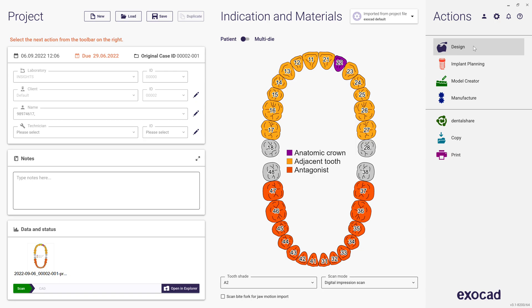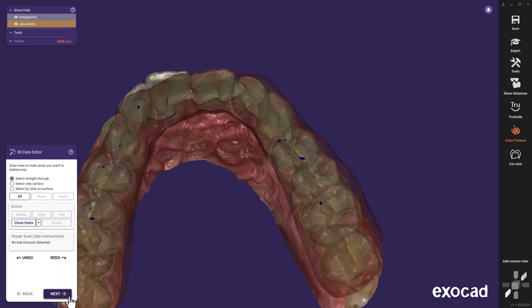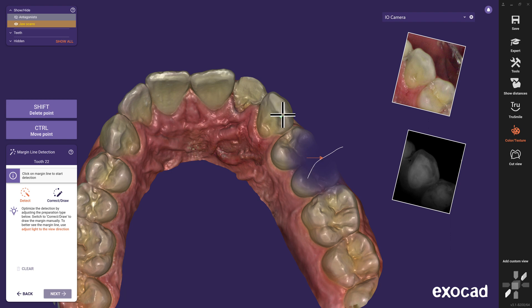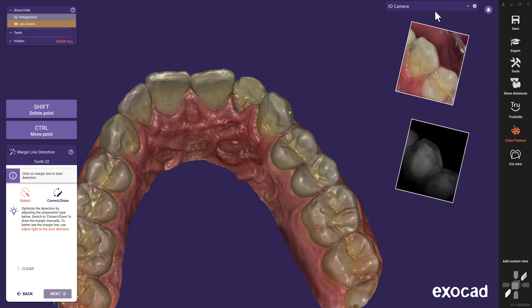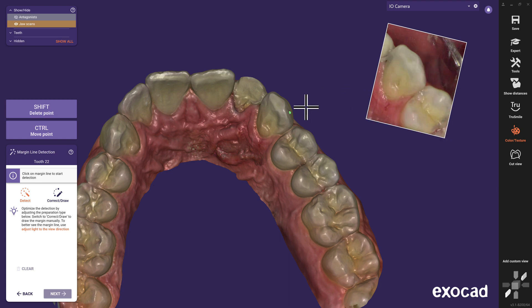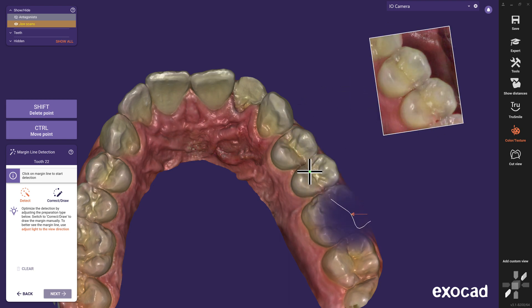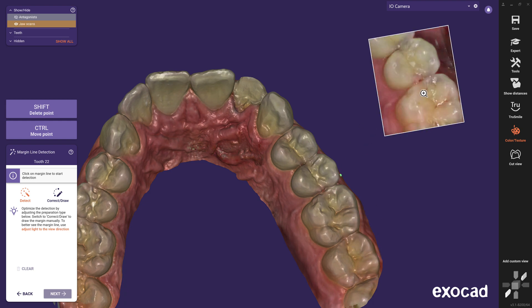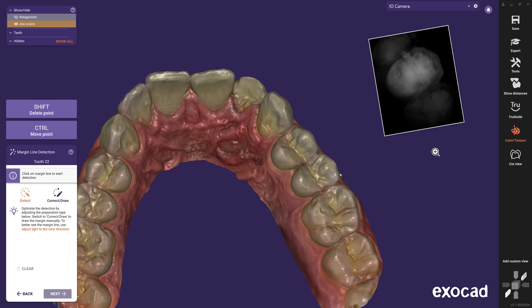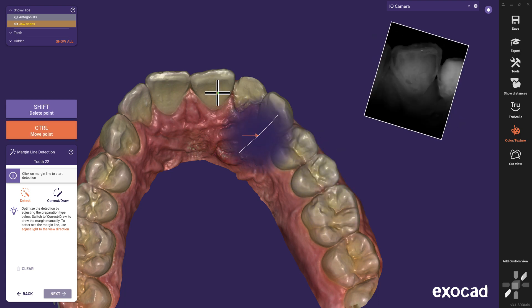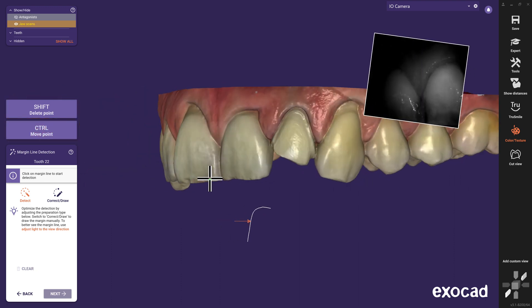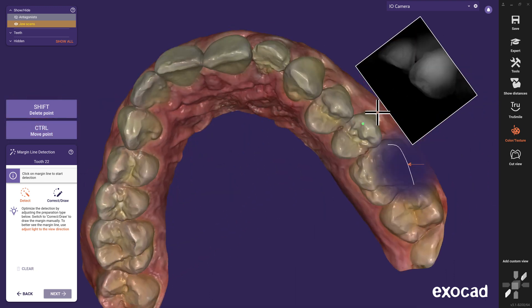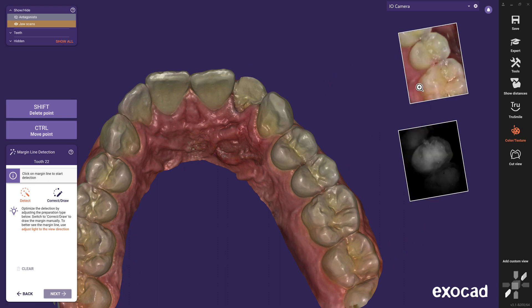After starting the design, we skip the first two steps in the wizard until the margin line detection step. Automatically, the new tool will appear and you can move it freely on the screen. Both the 2D pictures and Niri images will show up below the I.O. camera window. With a click on one of the pictures, you can enlarge it. Move your mouse above the 3D model and the viewer will automatically show the corresponding picture that your cursor is pointing at. A further click afterwards will reduce the picture again.